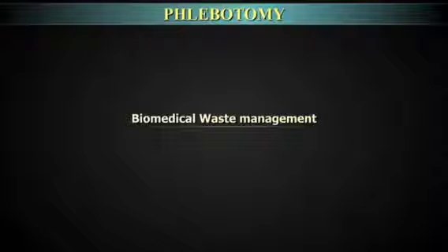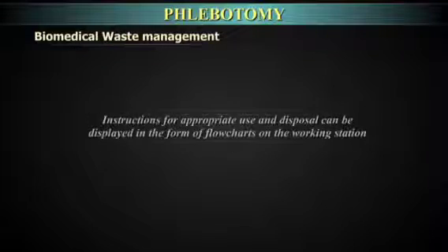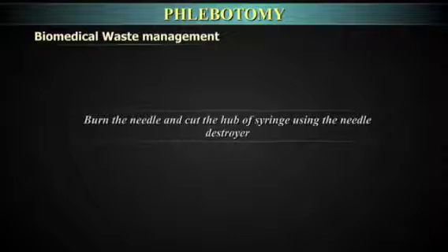Biomedical waste management. The sharps container must be within arm's reach and clearly visible to ensure safe disposal of sharps. The instructions for appropriate use and disposal can be displayed in the form of flow charts on the working station. Burn the needle and cut the hub of the syringe using the needle destroyer.